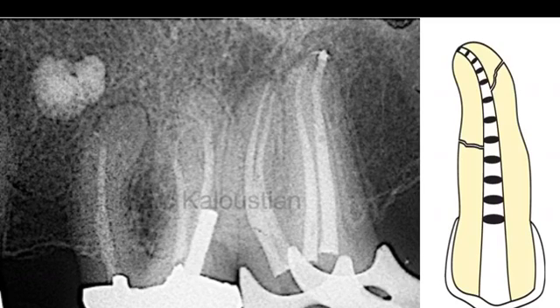And the idea here, you can see it on the right. We have a tooth. You can see these black circles. The idea is very simple. Each one of these circles, at the foramen we should have the smallest circle and then bigger, bigger, bigger, bigger. And we need to do this on the X-rays. We need to do this on every case that we are working on.